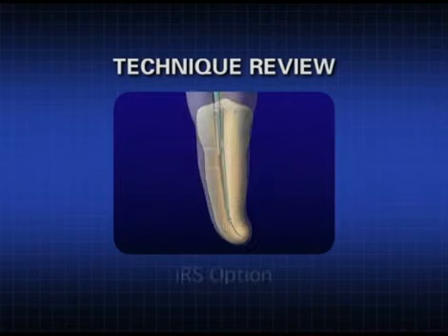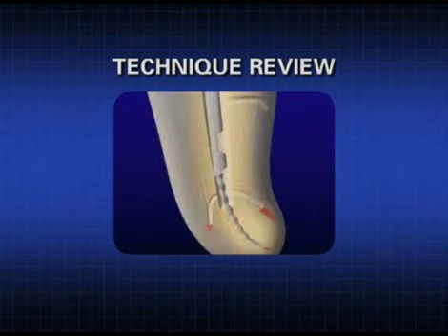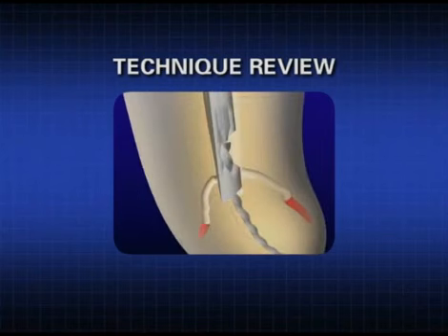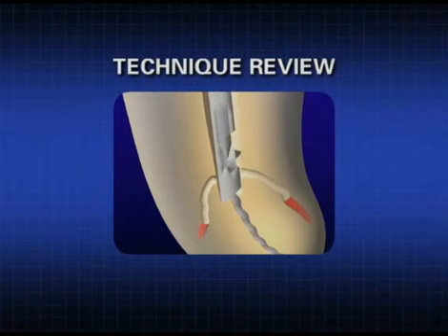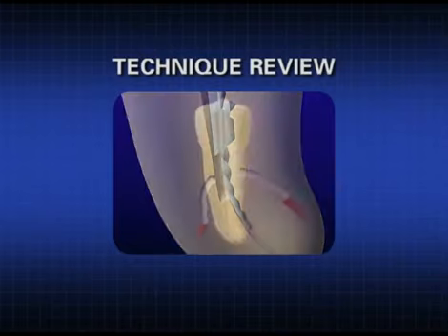In these instances, use the IRS option. The microtube is introduced so its beveled end is oriented towards the outer wall of a canal curvature. This facilitates scooping up the head of the broken file. Once the microtube is fully seated, the screw wedge is inserted and internally approaches the broken file when rotated counterclockwise. The screw wedge then engages and displaces the head of the file out the side of the window, allowing for a strong mechanical purchase and the removal of a broken instrument.